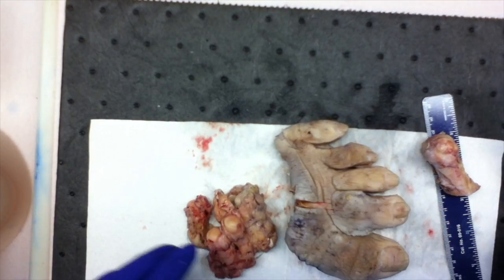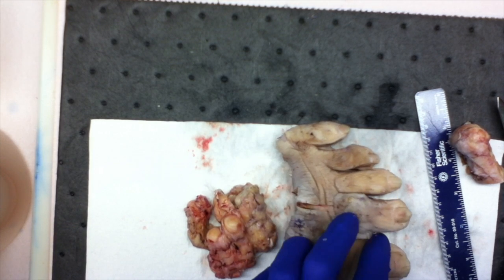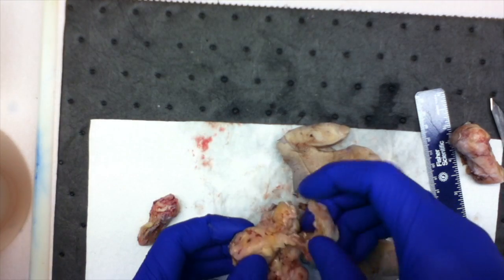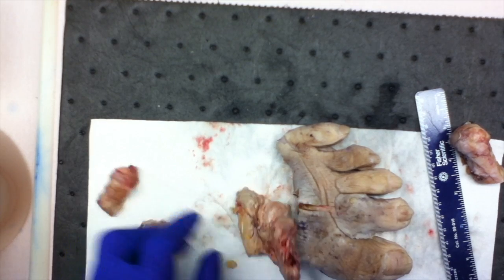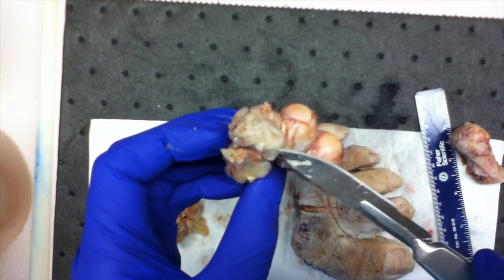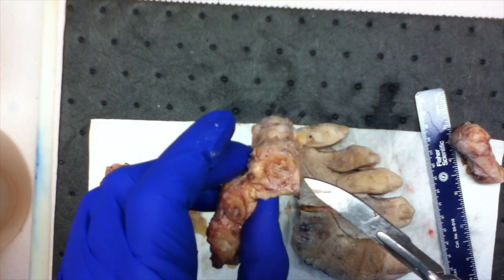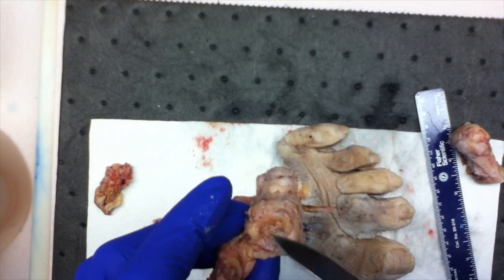Okay, so I did my clinical look it up. We're worried about the second and fourth proximal phalange, the third middle phalange, and then the second metatarsal bones as far as being our worry for osteomyelitis. You can see the second metatarsal head actually has a little bit of exudate looking stuff on it, so that is concerning. There's our bone margin. So any bone that we take for osteomyelitis, we also want to take the bone margin.